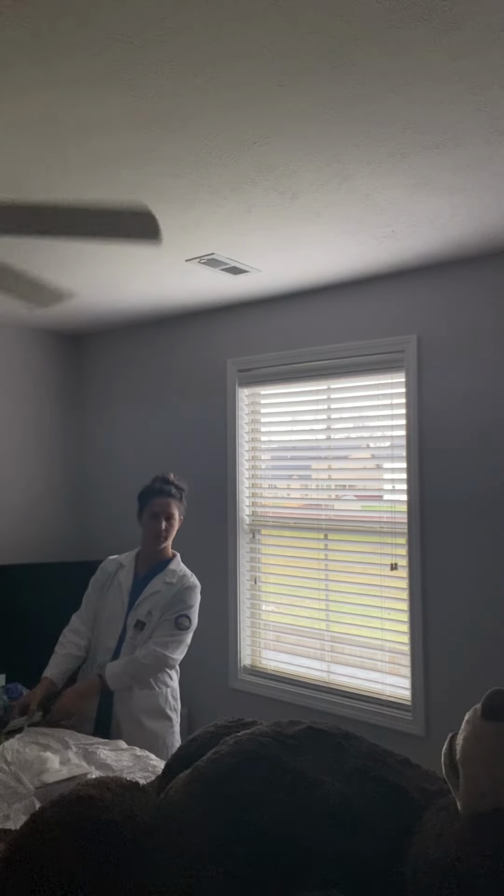All right, so now we're going to do the sterile gloves. So I'm going to make sure that you can see me. And making sure that I don't touch my sterile field. All right. So pulling it open.